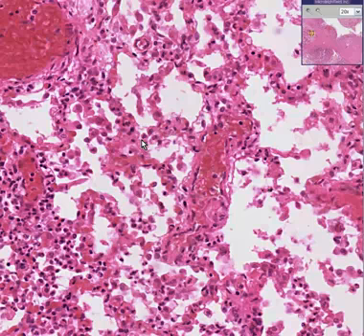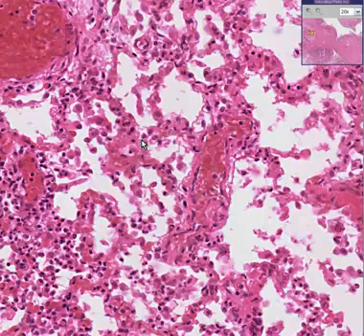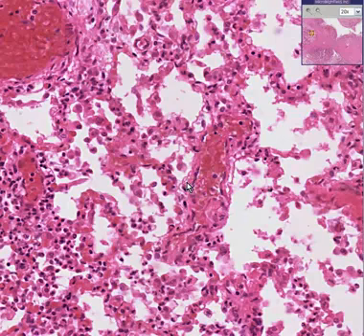Bronchopneumonias are called bronchopneumonias because they generally start out in the bronchi. Lobar pneumonias can generally start in the alveoli and involve a whole lobe of the lung perhaps, but the bronchopneumonias start out in the bronchi and bronchioles, and eventually they spread to the lung. And any type of pneumonia, if severe enough, can cause a well-defined pus pocket called an abscess, and that's exactly what we're dealing with here. We're dealing with a bronchopneumonia that has been severe enough to cause an abscess.